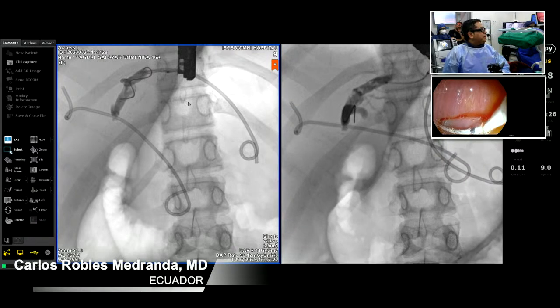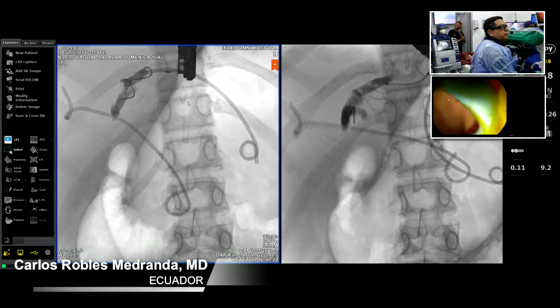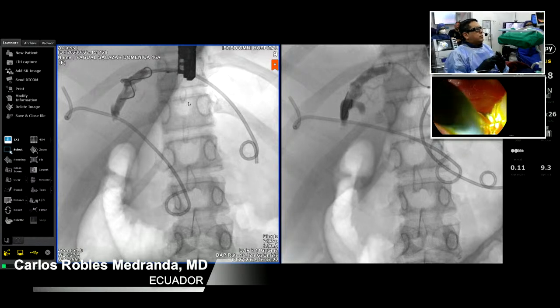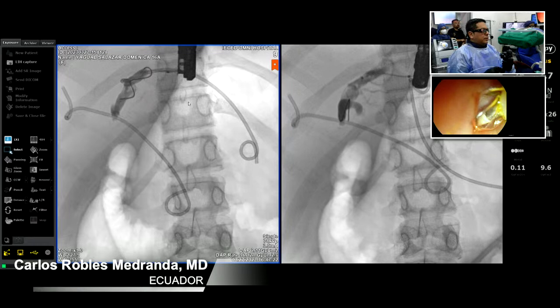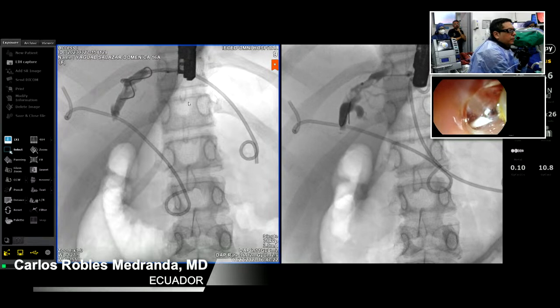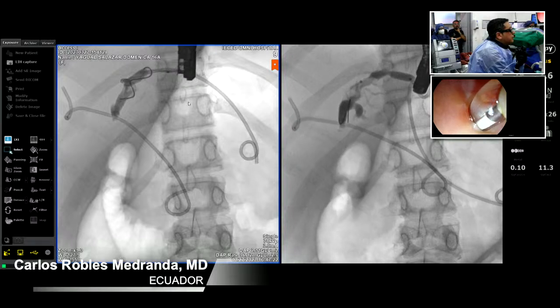Second. One moment. Second. Let me see. Deflate a little bit. So I need to deflate. Now, okay, dilate. So it's very important the position. One moment. Yes, continue. Continue. So now we have a very good pressure.